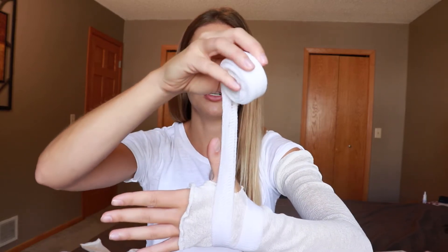Come around the wrist, just holding it with your finger until you get around. Once you can anchor it down, move on. On the back of the hand, come all the way over to the thumb. What I tend to do is come all the way to the top knuckle for each finger and then work my way back down the finger. That helps avoid anything snagging on extra fabric and keeps it all in place.